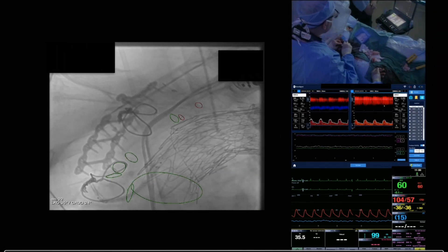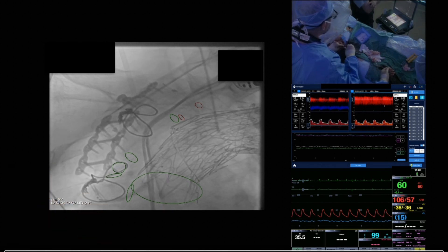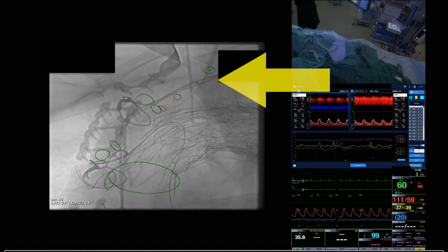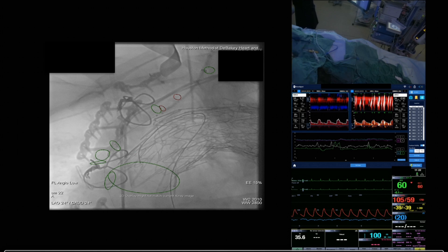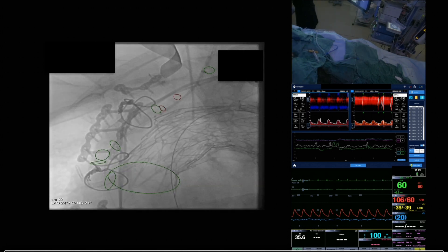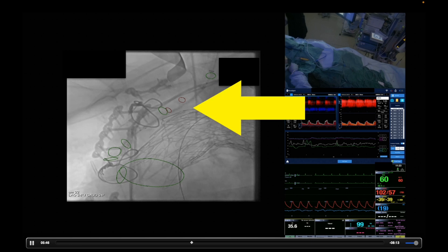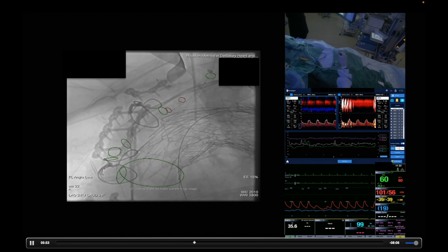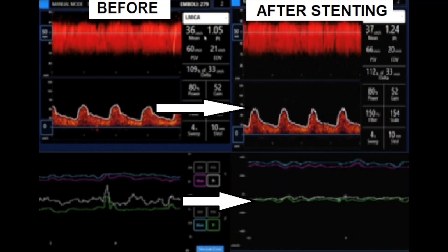Access of the lesion with a wire from the aortic arch was unsuccessful, probably due to the complicated post-surgical anatomy. The surgeon then reached the stenosis through a common carotid puncture after surgical cut-down of the neck. We see embolization on the left MCA on TCD as the wire with the stent crosses the lesion, and also some hits as the stent is being deployed. After stenting of the proximal CCA, our left MCA waveform improved from blunted to one matching the other side better.